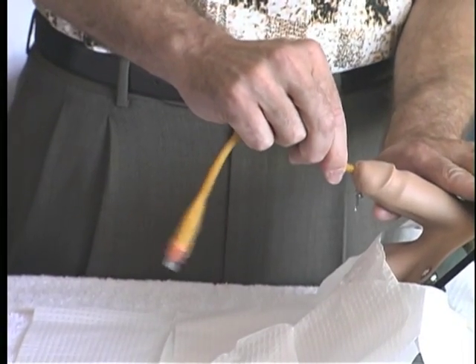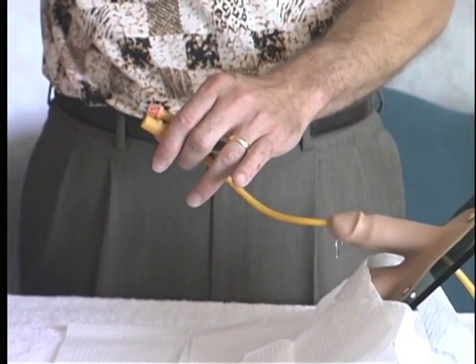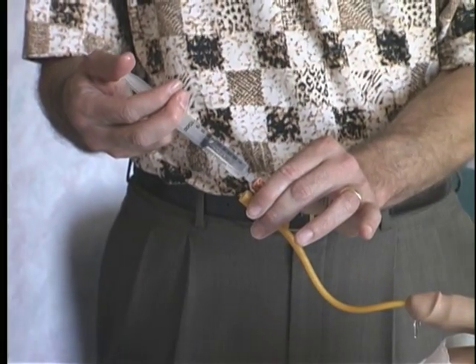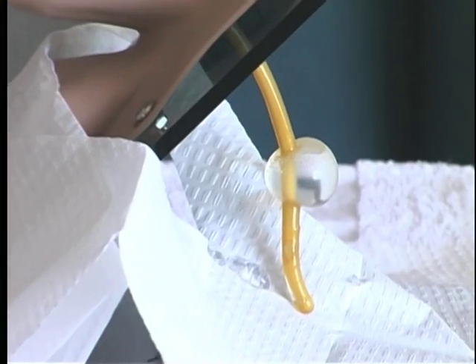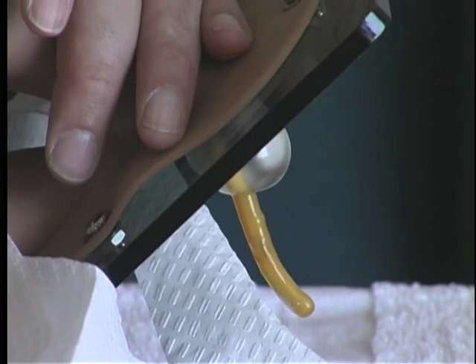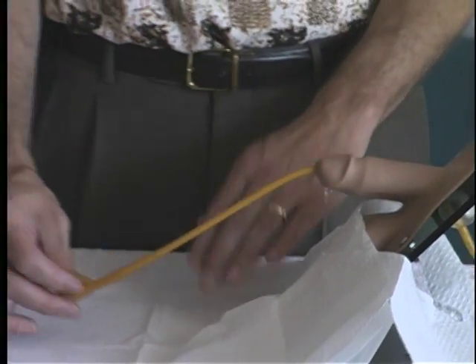Upon complete passage through the prostate, the curve of the catheter is pointing up towards the umbilicus. Generally, we're supplied with 10 cc's of saline or sterile water for blowing up the catheter's balloon. We recommend inserting all of that. This allows for catheters to remain in place even in the presence of a confused patient who cannot pull the catheter out. The catheter is brought gently back beyond the prostate, or to the level of the prostate, and it's connected to straight drainage.